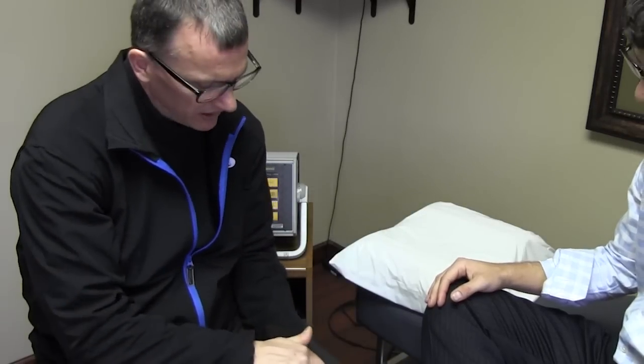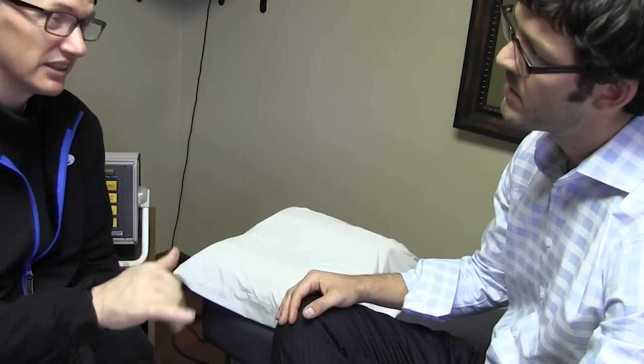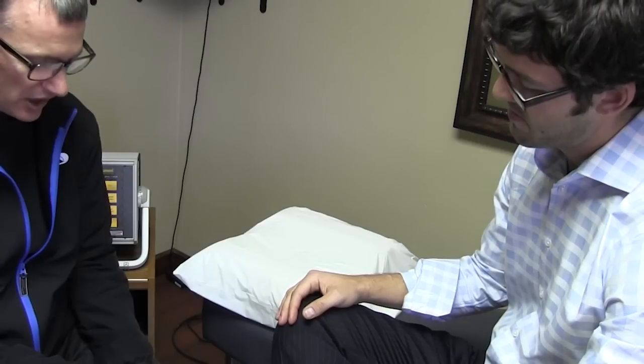So if I go on the flip side here, for your age, we're 30 to 39 and you're 32, the large artery elasticity, we want to see it over 14, and you were 19. Okay. So for your age group, you're really good. And if we go in the younger age scales, what we're seeing is that you have the blood vessels of a 15 to 19-year-old for your age. So you're a testimony to how healthy lifestyle choices is slowing the aging process for you. And so that's good.